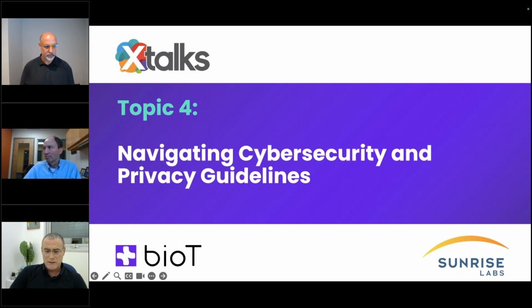You need to submit as part of your FDA submission the plan on how you are going to treat vulnerabilities and do threat assessment and so on. So you should know that when talking about what a cyber device is, and that's regardless of the cloud or not.